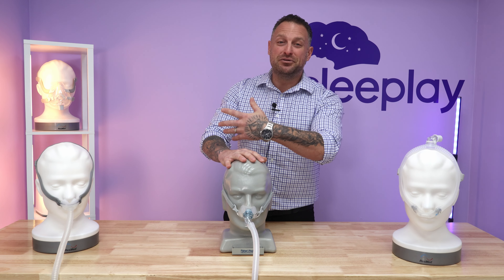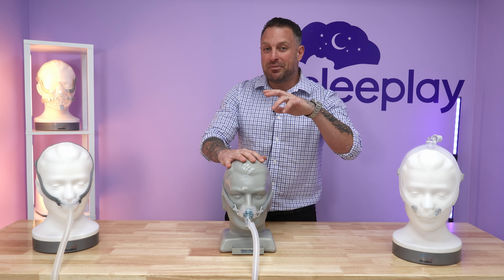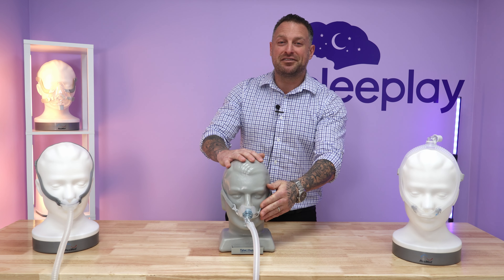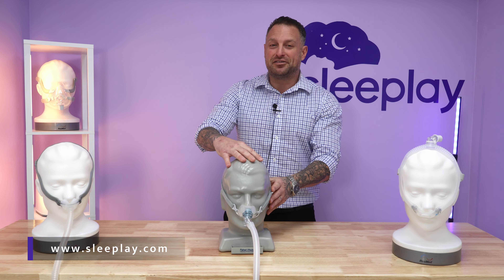If you like Fisher & Paykel and you're someone that leaks a lot — if you use a nasal pillow mask and you're trying to minimize leakage and don't want to switch to something else — try out the Fisher & Paykel Brevida. This mask is it. It's a great and sturdy mask as well.